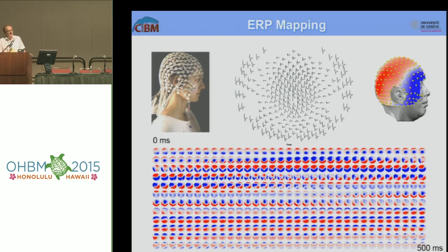And if you look at that already here, just visually, at these evoked potentials, you see right away what is also a definition of an evoked potential component: a stability of the field topographies. You see periods, and I try to illustrate that a little bit by animation, if it still works. Yes.